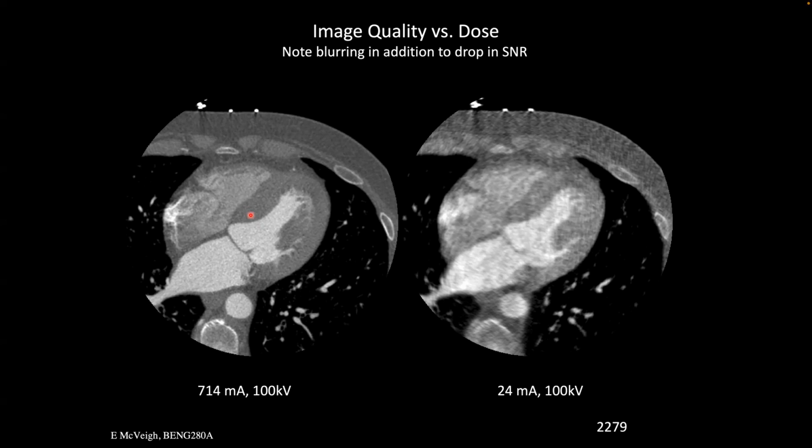Yeah, basically like an MRI, similar, although it's cheaper to install, and it's cheaper to make the room. Because with MRI, you have to actually put the scanner in a Faraday cage. You have to make the room RF silent. So you go to these companies and the only people they usually build these for are like the CIA and people like that, right? Where you need a room that nothing gets out, nothing comes in.